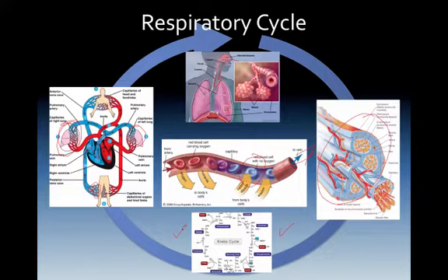The CO2 is then carried on the red blood cells back through the respiratory system, and your exhalation is what we see in that. Now the end-tidal CO2's part in this is that it takes a look at the CO2 that is expelled and will give us an overall look at this entire process. Are you moving red blood cells through the system appropriately?